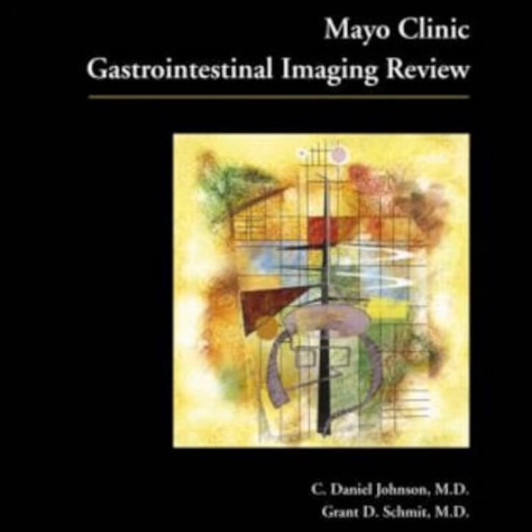So what does a benign sump ulcer actually look like? A benign one presents with a central crater surrounded by a smooth, symmetric mound of edema, and the crater itself typically projects outward. It doesn't extend inward beyond the normal gastric lumen contour. So the rule is clear. Location is just an unreliable predictor. You have to analyze the physical architecture of the lesion. You have to look at the shape, yeah.